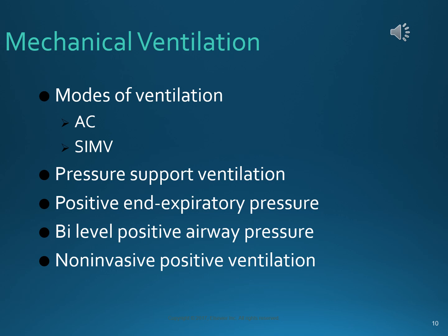It's just continuous pressure. BiPAP, on the other hand, is a machine that is programmed to deliver air at a specific pressure on inhalation and then a specific pressure on exhalation. So it's bi-level. It's two levels of positive airway pressure, a little bit more on inspiration and a little bit less on expiration, so the machine senses when the person inhales and exhales. This is usually what you'll put somebody on before you intubate them and put them on a ventilator. This is like the last resort to help somebody breathe and to keep them off a ventilator.